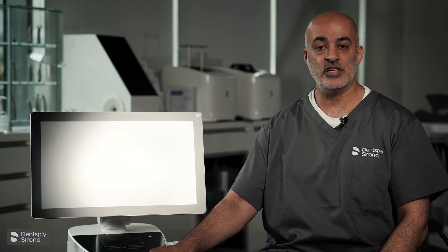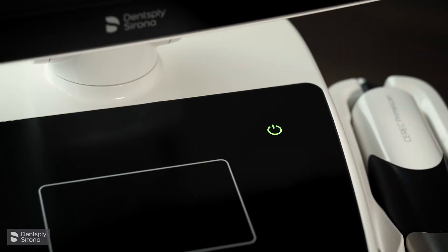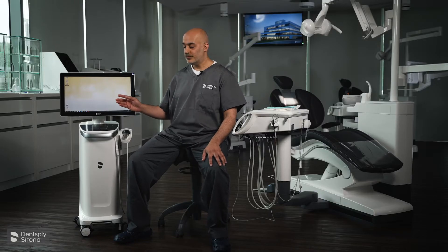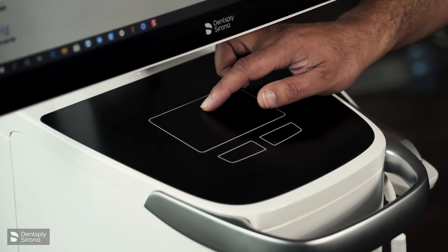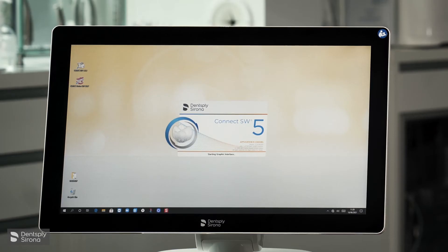If you ever see the red light, there's a technical error and you need technical support. To start the Prime Scan, press and hold the button and it will start to boot up. This is the desktop — we have the software programs on the desktop and we can use the trackpad or the touch screen to activate any of the software programs.